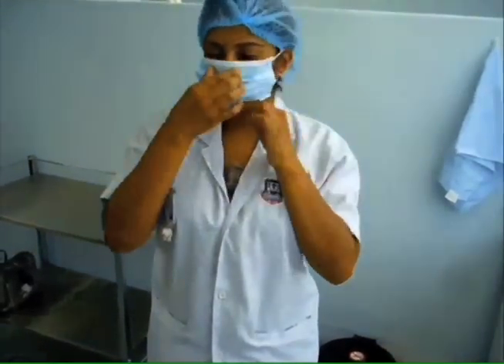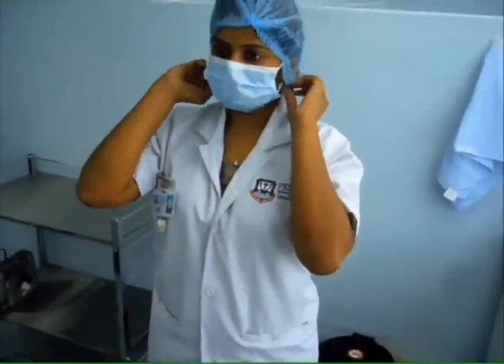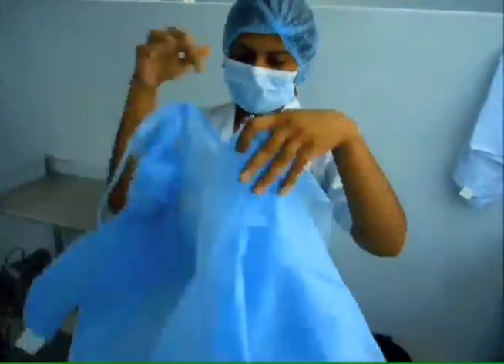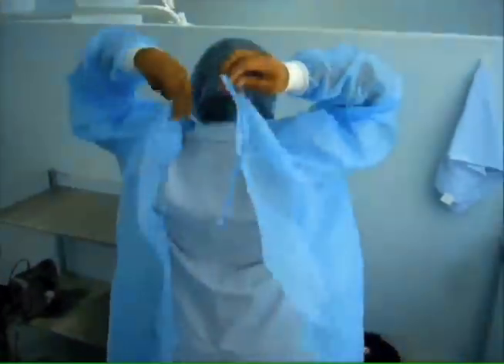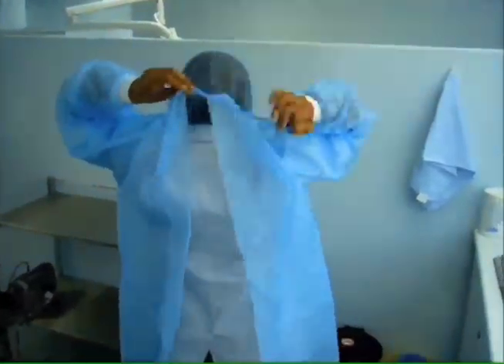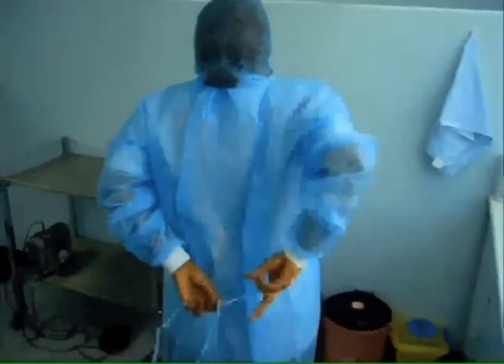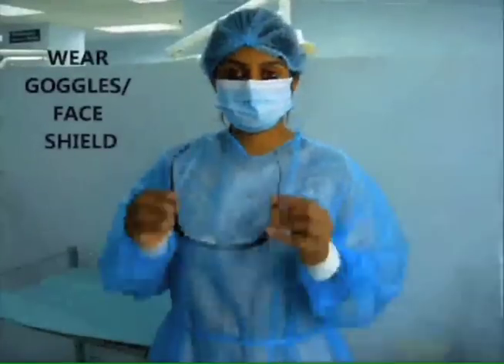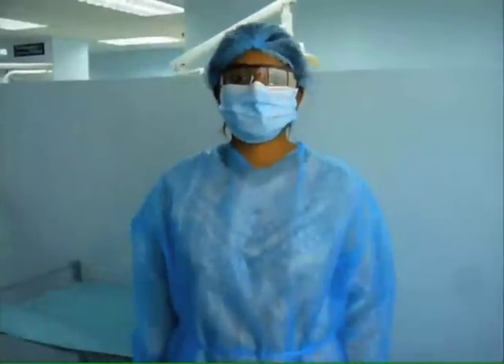The mouth mask can now be worn. Pick up the gown in such a manner that hands touch only the inside surface. Hold your arms out and slightly up as you slip your arms into the sleeves. Tie the strings. After the donning of head cap, mouth mask and gown, goggles should be worn.